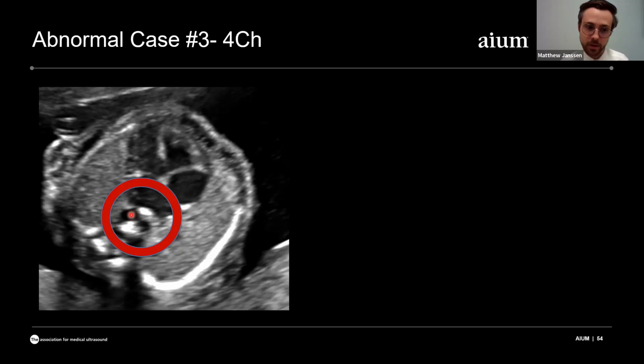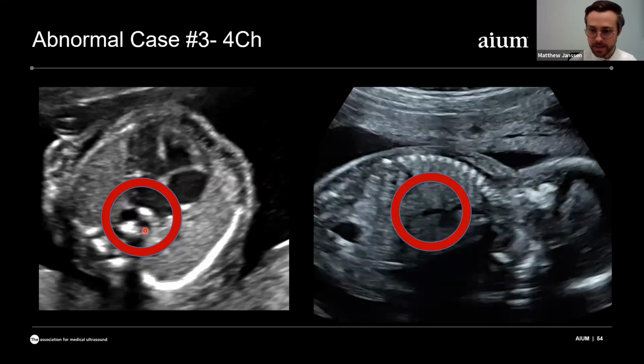It's the descending aorta off to the fetal left of the spine. And so this vessel here to the right of the fetal spine also clues us into what's going on, along with seeing a dilated SVC in the 3-vessel tracheal view. And so that can lead us to progress to a bicaval view, which confirms our suspicion that maybe what we were seeing is a dilated azygous vein, and then searching for the reason why we were seeing a dilated azygous vein.